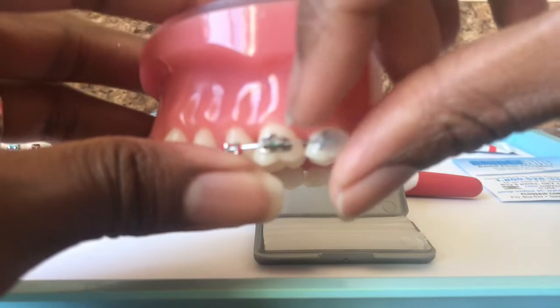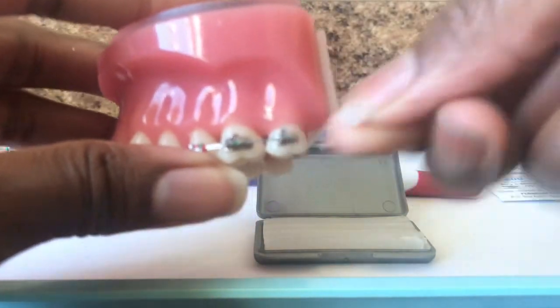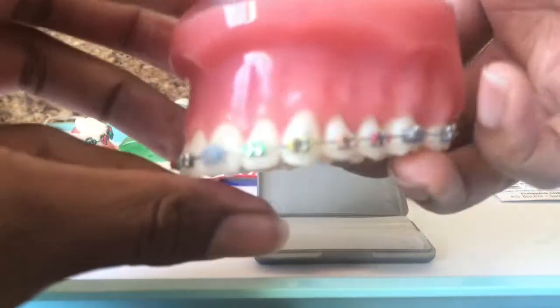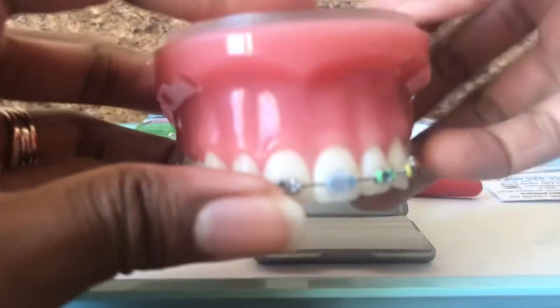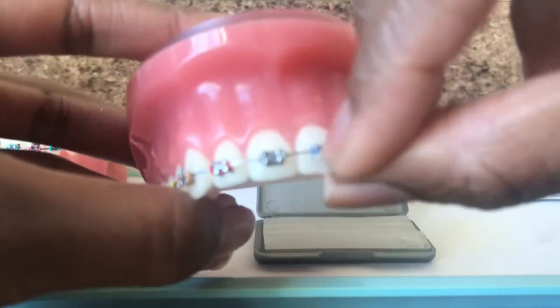To take the wax off, you would just take a small pinch of the corner and it'll come right off. Just taking a small pinch of it with my finger, and it comes right off.